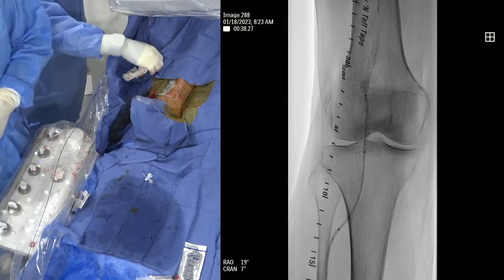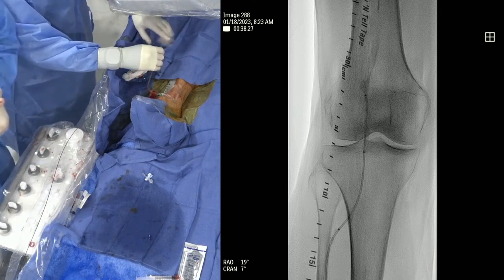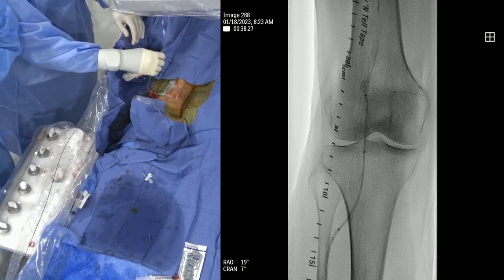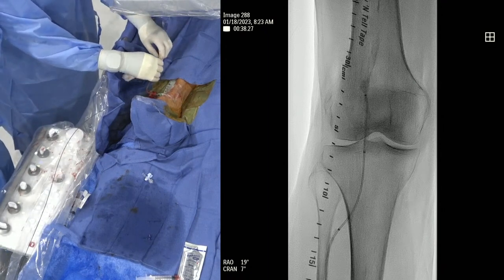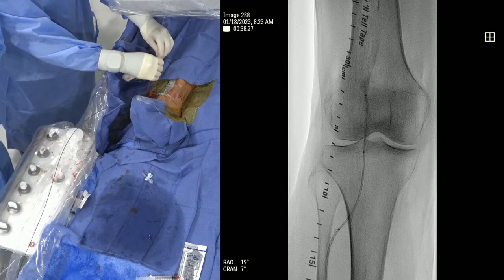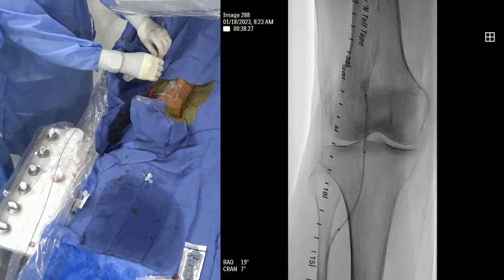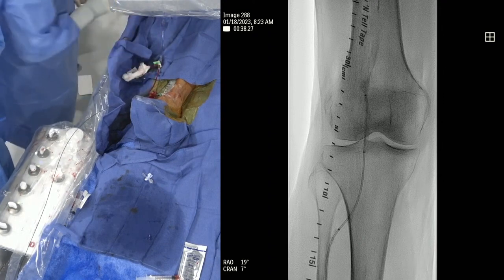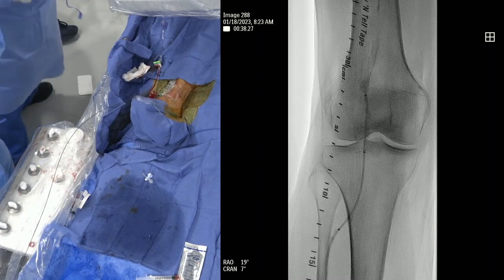But Ajit, does it make sense to treat just the pop? Because to me, if your common femoral inflow is bad, you don't have an internal iliac filling the profunda, right? Correct. So now you've got complete cutoff to the common femoral and the profunda, and now you fix the outflow. Do you think that would really help? No, I mean, in this case, it doesn't. We can't do that. But in general, when you're going in the direction of flow, potentially you could just treat one level, like the common femoral, and then see how she does.